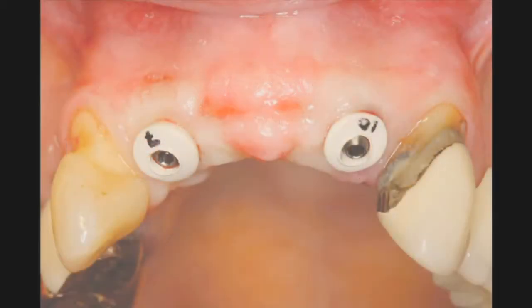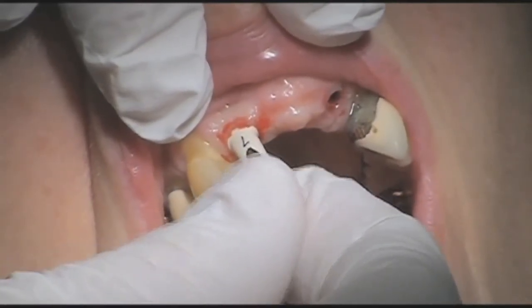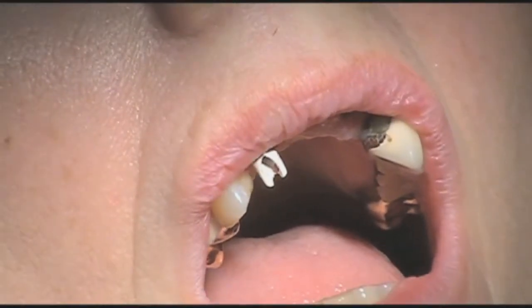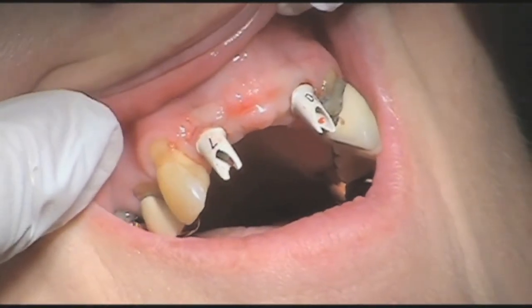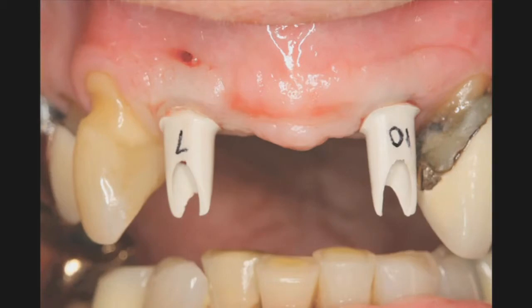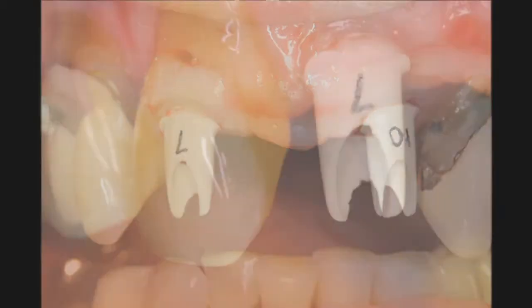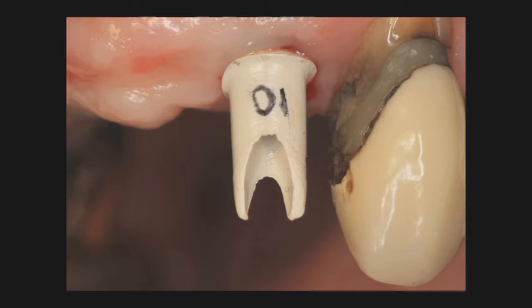transitional healing abutments to allow for some soft tissue contouring immediately following surgery. Because the implants were indeed torqued to 35 Newton centimeters, I decided to go ahead and place our temporary abutments, positioning them into place to accept the provisional bridge from maxillary right to maxillary left lateral incisor. Tissue contours are being established for the first time right following surgical placement of the implant. This is an amazing step towards prosthetic reconstruction.